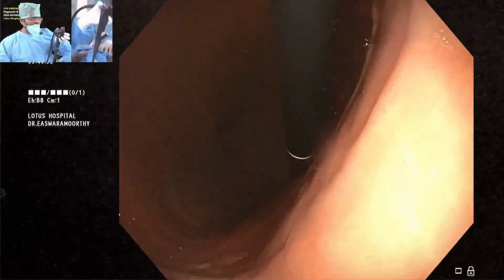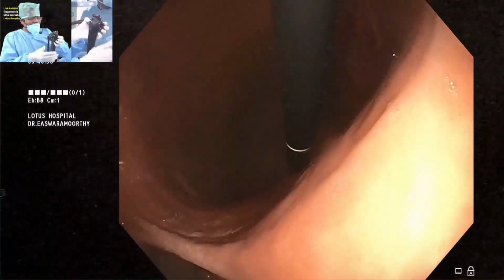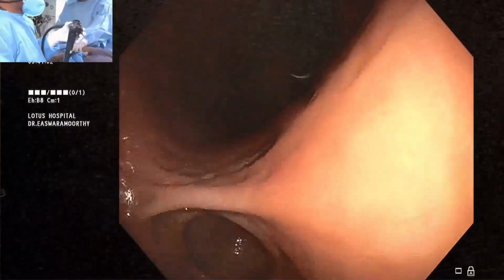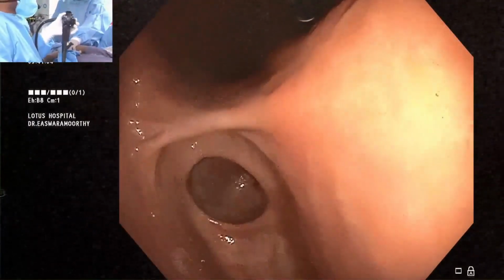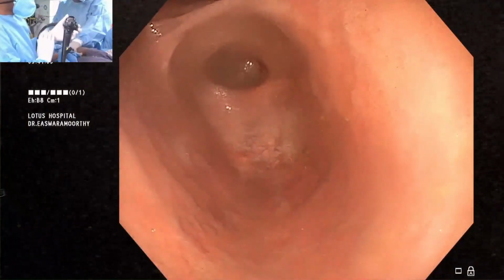In other words, the wheel should be on your right and all the buttons should be front. This should not be done this way. Sometimes people inculcate these types of habit from their seniors, but I would resist doing that. You keep it always like this, and even 100 cases you do, you don't have any wrist strain.